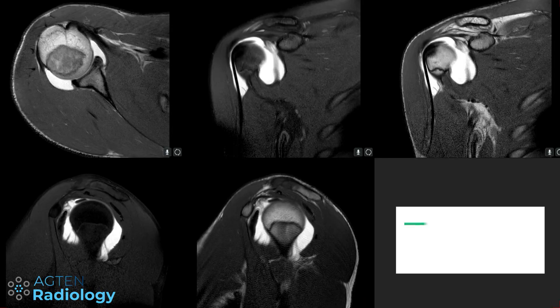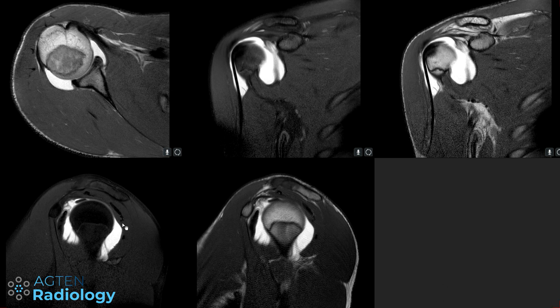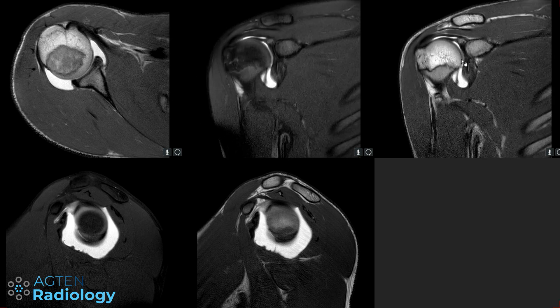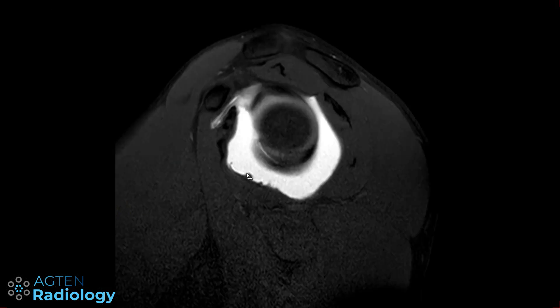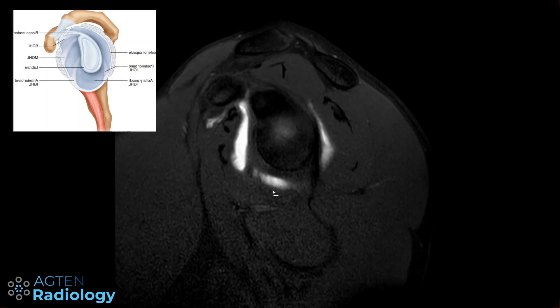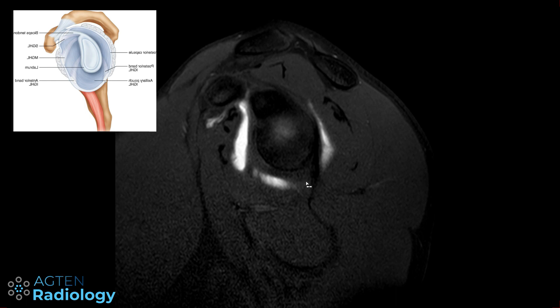I have to start with a quick warning: there is some serious scrolling through images going on in this video. Let's have a look at a case with normal anatomy. We have T1-weighted sequences with fat saturation and proton density-weighted sequences. On the T1 sequence, this is the glenoid, this is the humeral head and subscapularis tendon. Going down, you can see different bands bridging between the humeral head all the way over to the glenoid.